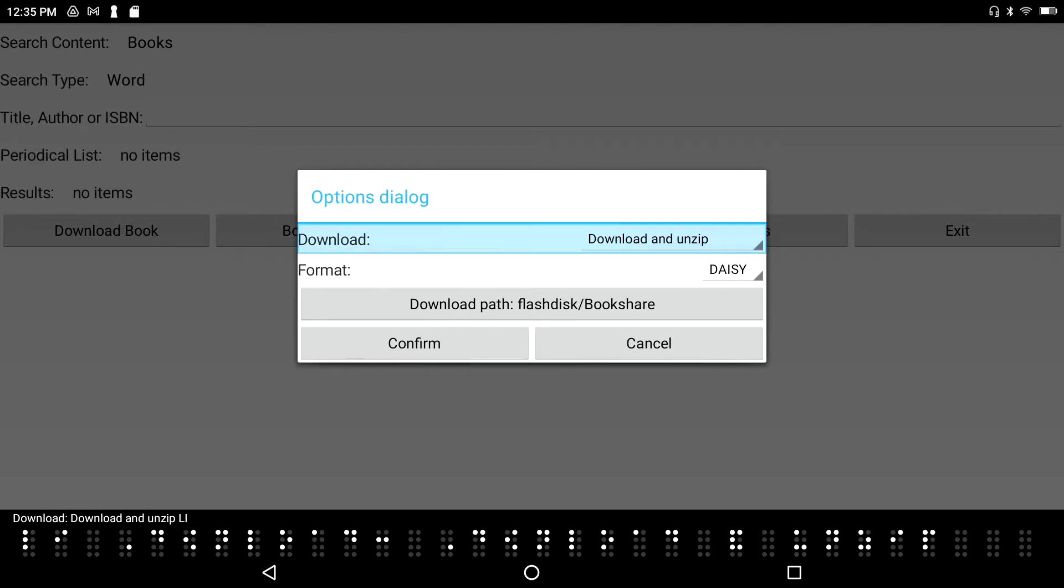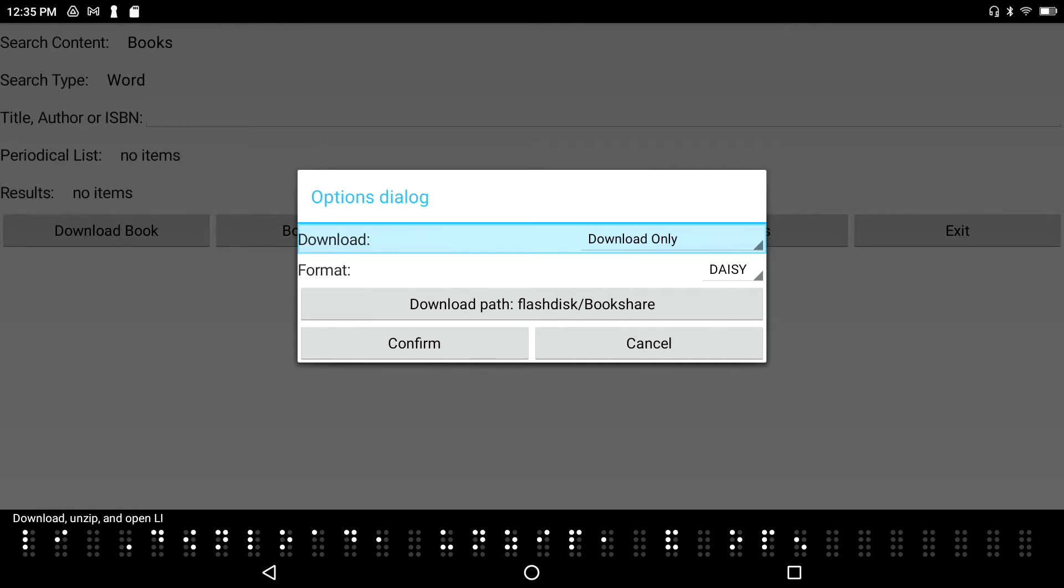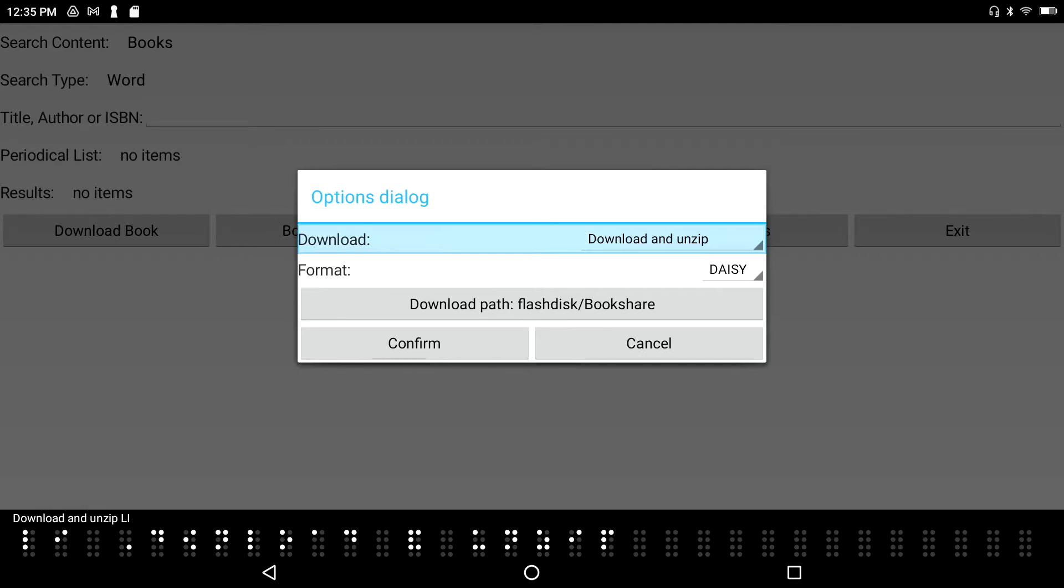More often than not, I'm going to want it to download and extract so I don't have to go through that extra step. I don't want it to open up the book in the Daisy book reader because I might just be on a hunt for new reading material and I don't want to have it open just because I downloaded it.